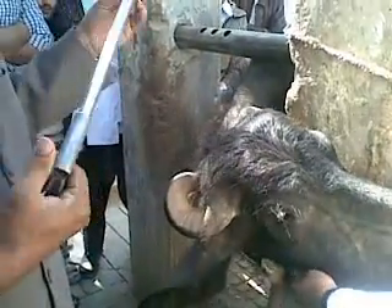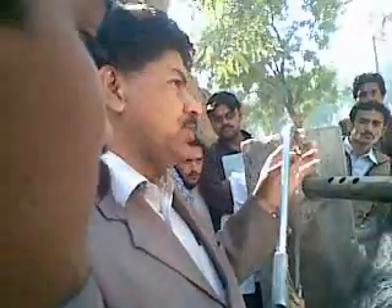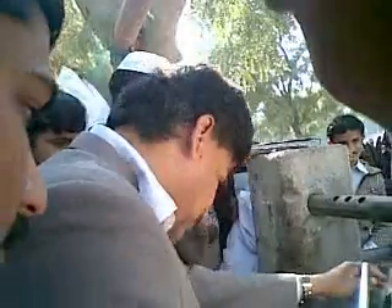We have two instruments: the de-horning saw and de-horning wire. Actually, we are using over here a de-horning saw. It's a common blade which can be purchased in a trail.